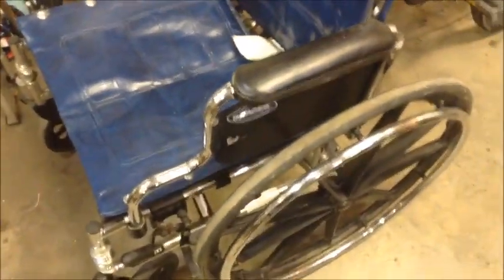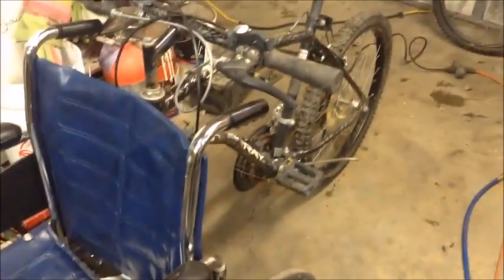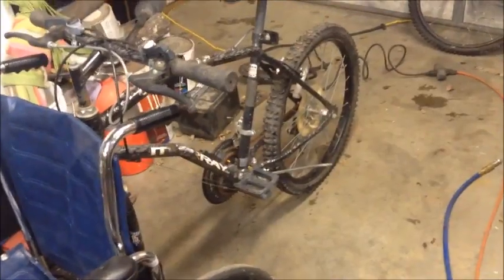Understand you've got a rear brake only, you don't have a front brake. Still got these parking brakes on the wheelchair itself. Or the person in the chair could grab onto the wheels and be the brakes themselves. I see they have the foot pads removed from this right now just because I'm rolling it around. But normally you'd have the foot pads up there. But, yeah, ride accordingly. And if you want to build something like this for yourself, that's on you.